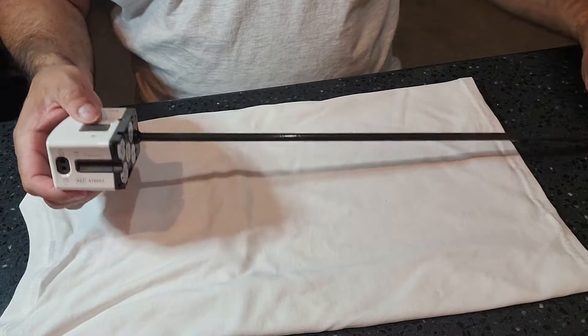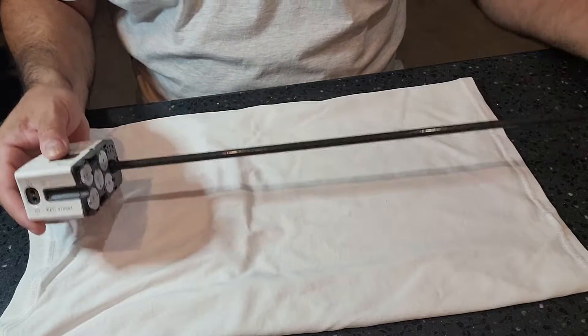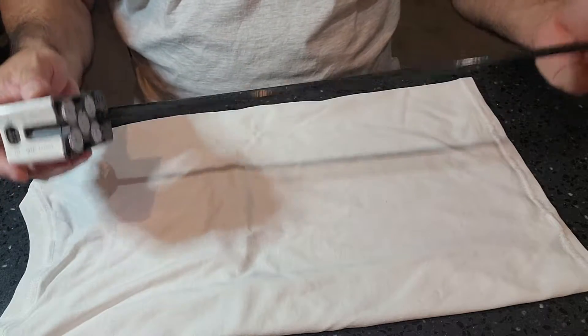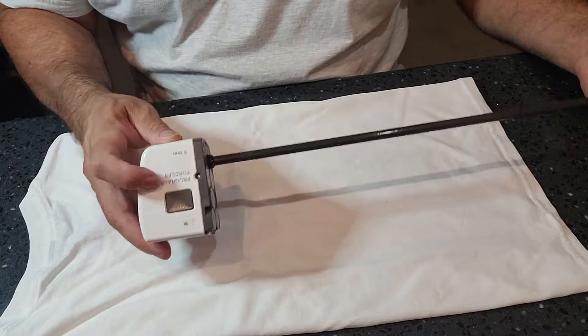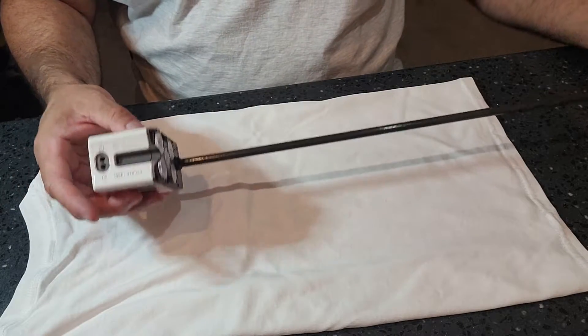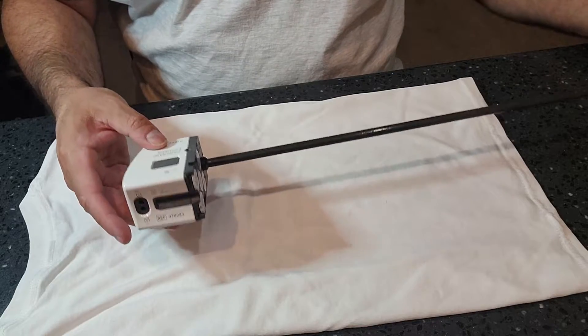This instrument does have a usage life and a sterilization life — not the same thing. Usage and sterilization are two different things. A lot of them have different usages, so I'm not going to tell you what this one is because I don't have the IFU in front of me. But please pay attention to that — there is a usage life and a sterilization life.